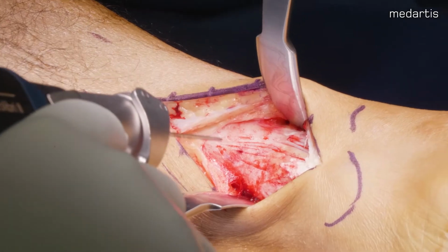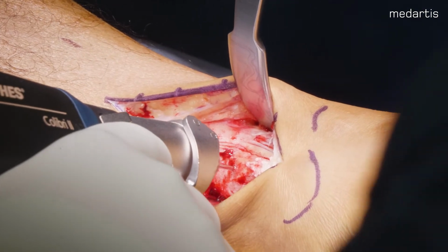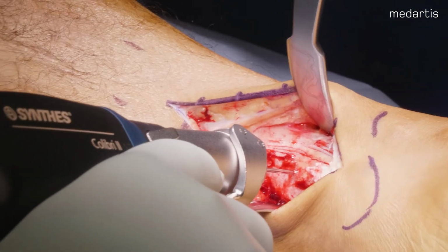The osteotomy. 2 K-wires are inserted as guide wires at the area of the tibial flattening for the direction of the osteotomy and measuring the size of the wedge.